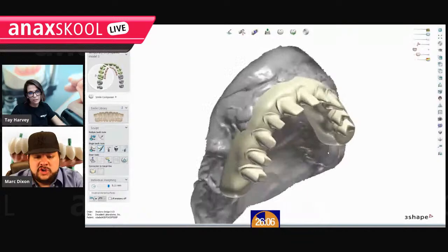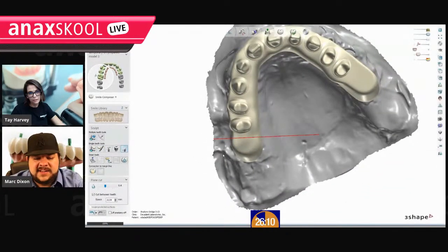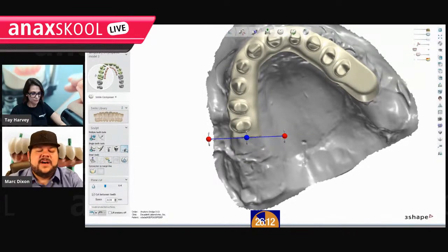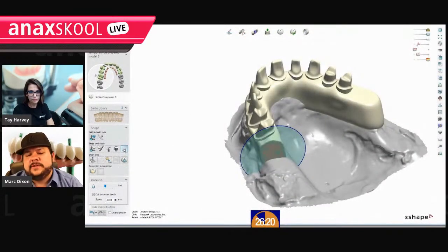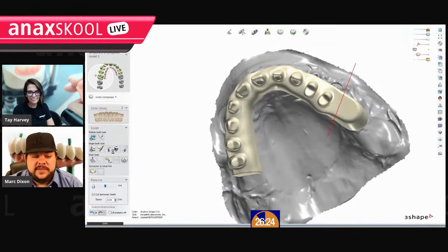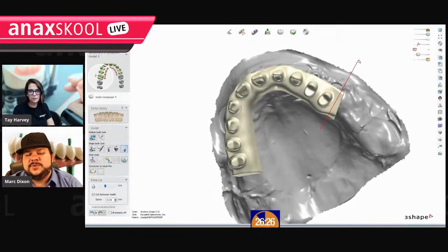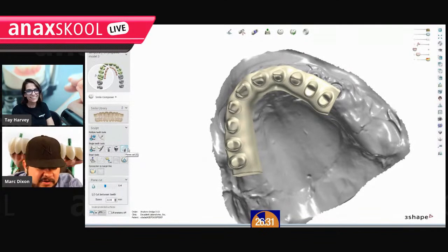So you do that, you morph everything, because we're going to do the crowns real fast. You cut some of this extra stuff off. If you don't know how to use the slice tool, I know people that would slice and say, well, what do I do next? It just stays like this. Just hit the slice tool again. I always thought that was funny. I didn't know either until somebody told me. But how are you supposed to know? Why can't there be tiny little letters down there that say to apply, click slice tool again?